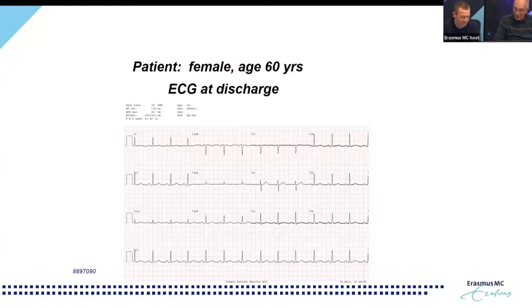I remember, because this comes out of the blue for patients, because they often have no cardiovascular history, not even known risk factors. Absolutely. All right. So far the hematomas then.